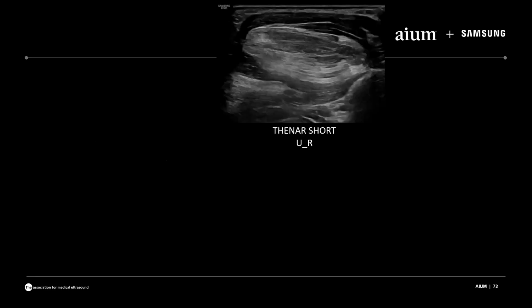So this patient presented with thenar eminence swelling. There was a concern for mass or edema. And we can see a short axis view here. We've got this ovoid, heterogeneously echogenic, striated mass-like focus.